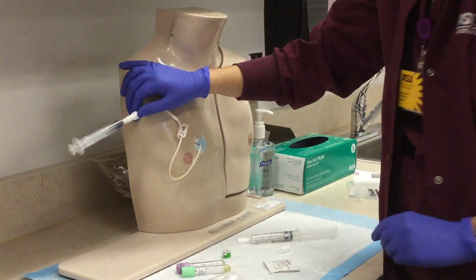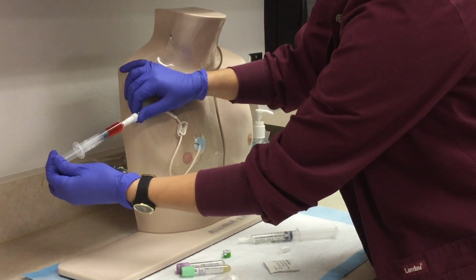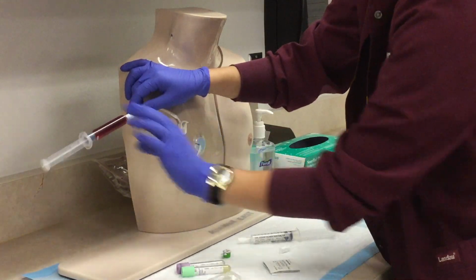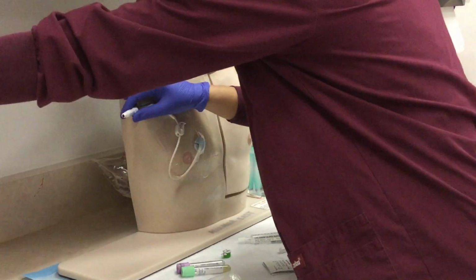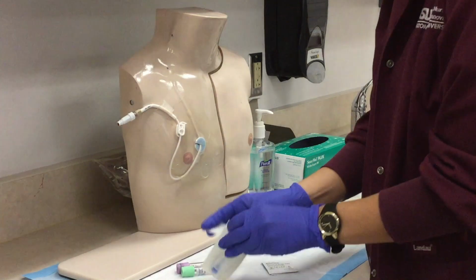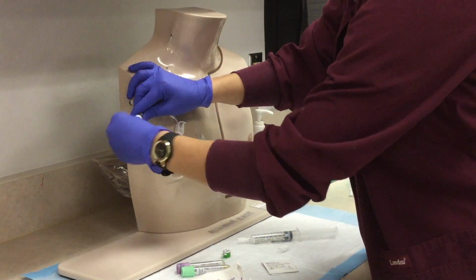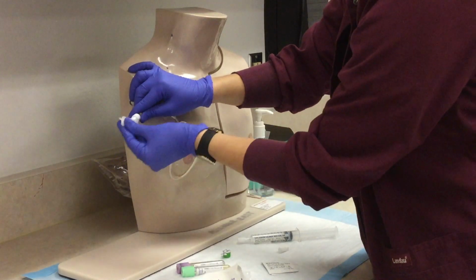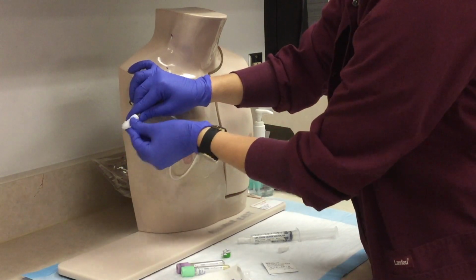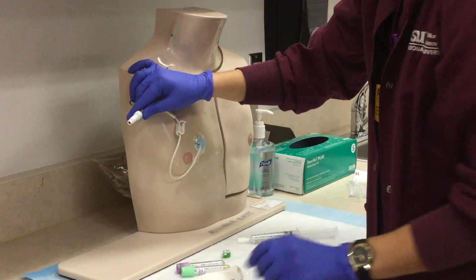Now you are going to withdraw 10 milliliters of blood to waste. After drawing your waste, you will reclamp the catheter, remove the syringe, and dispose in the biohazard container. Now, clean the hub again. You will do this for 30 seconds. Once you are finished cleaning the hub, you will then attach a vacutainer to the hub and unclamp the catheter.